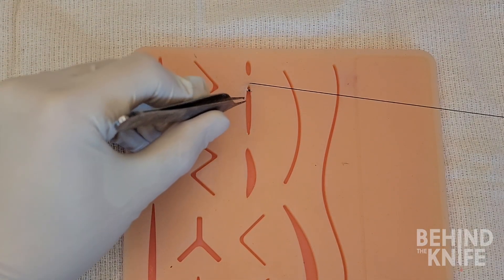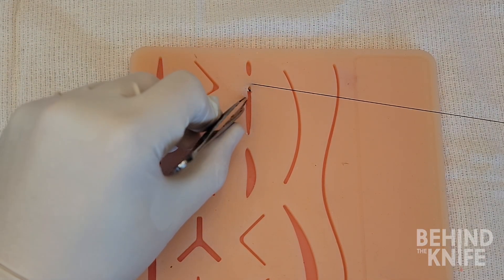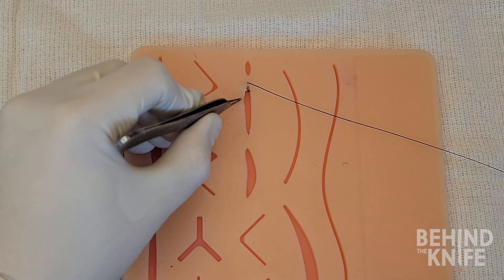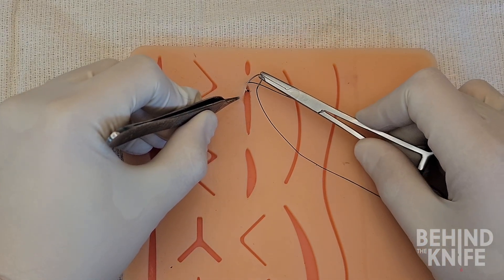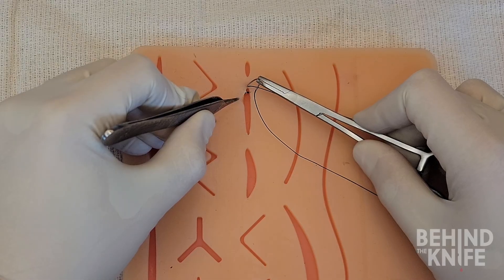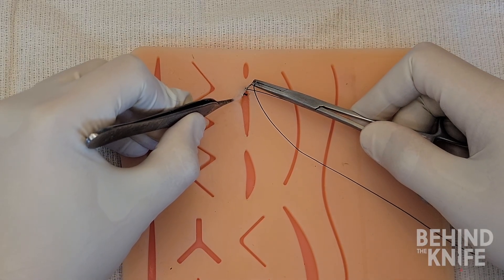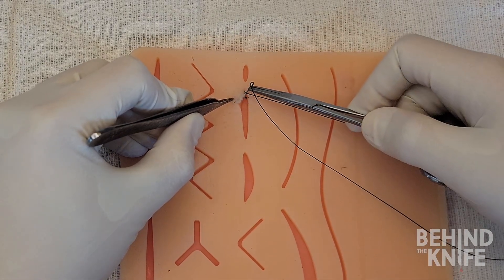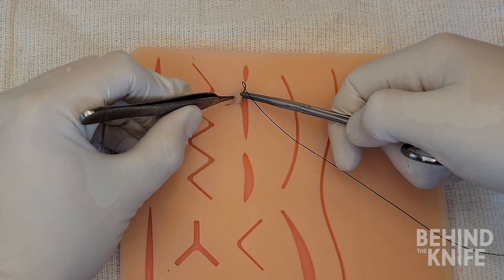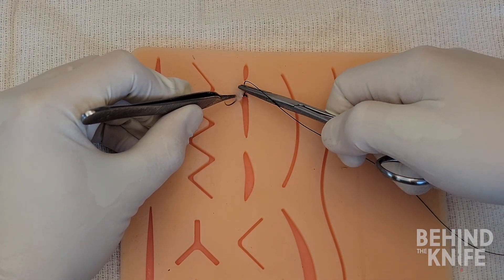We can now start the running portion of the suture by taking alternating bites of the left and right side of the wound. To do this, I will use the teeth of my forceps in my left hand to grasp the very edge of the epidermis and pull the skin edge up while everting it to make passing the needle through the dermal-epidermal layer easier.